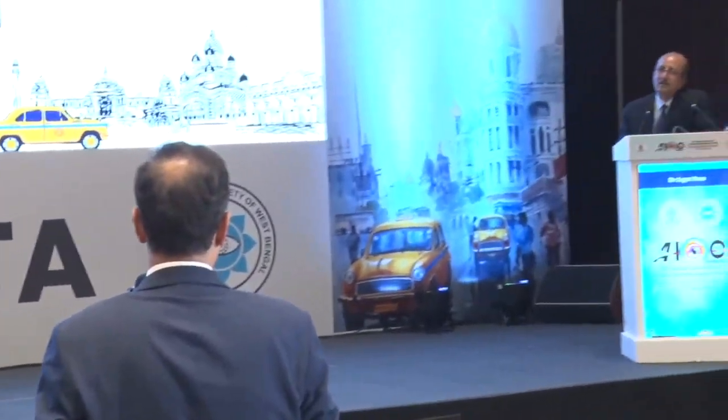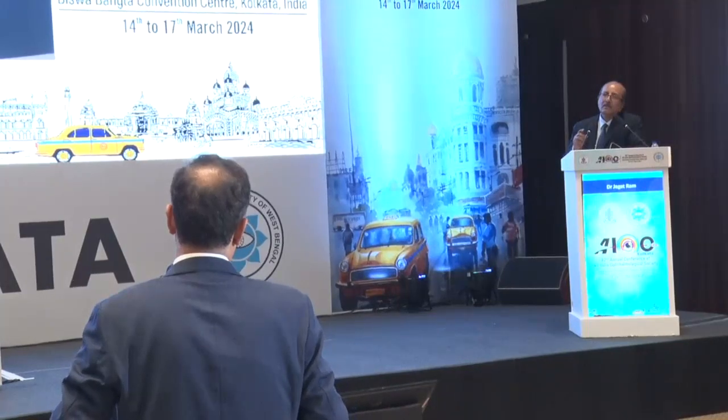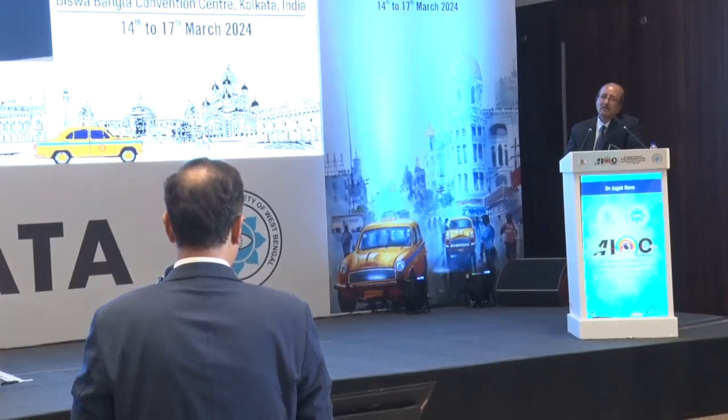Any questions, sir? I wanted to ask, especially for post-RK eyes, the power will probably come out much better with it. What about toric calculation? RK eyes are very challenging, and if you have to put a toric, it's very difficult to measure. So is ORA a good tool for post-RK eyes for toric IOL implantation as well?